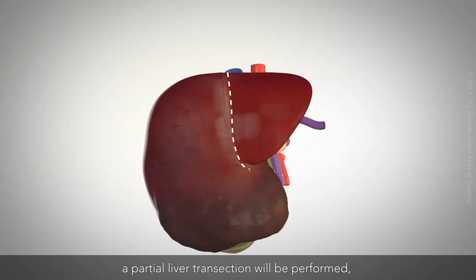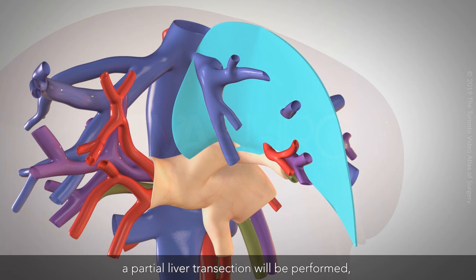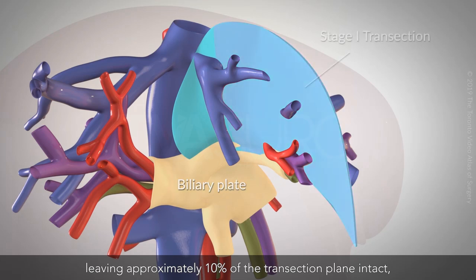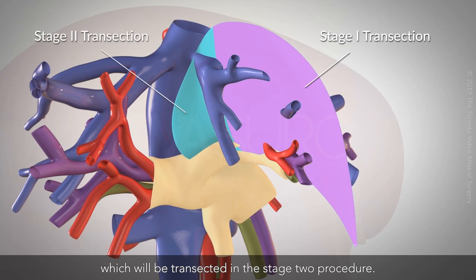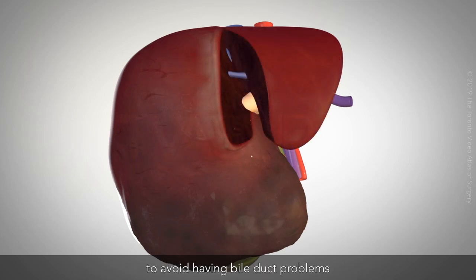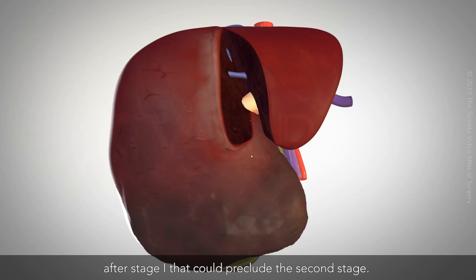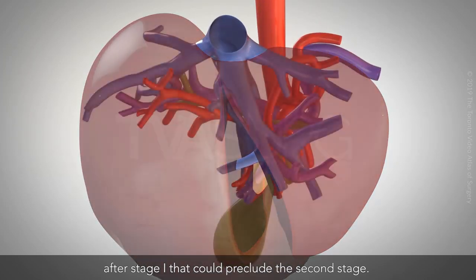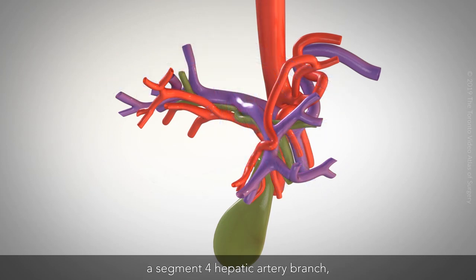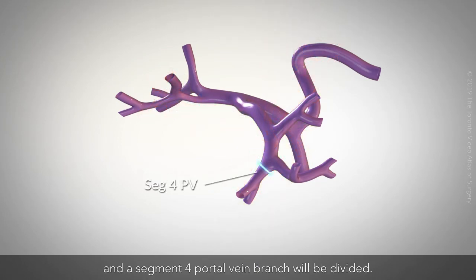In Stage 1, a partial liver transection will be performed to the level of the biliary plate, leaving approximately 10% of the transection plane intact, which will be transected in the Stage 2 procedure. The transection is done to the level of the biliary plate to avoid bile duct problems after Stage 1 that could preclude the second stage. A Segment 4 hepatic vein branch, a Segment 4 hepatic artery branch, and a Segment 4 portal vein branch will be divided.